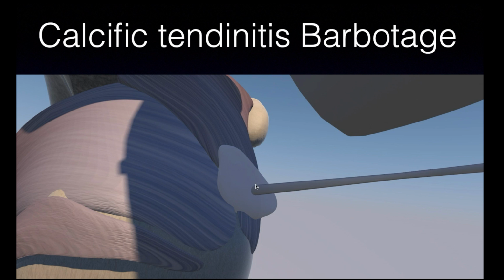So every time you inject saline, it's in a closed cavity, and the back pressure is going to come right back in your syringe. When you do these procedures, you don't have to actually pull back on the syringe. Once you inject, it usually just comes right back. And like Dr. Jacobson said, he had 3 syringes ready to go with saline. If you're not sure, maybe have 4 or 5, depending how big the lesion is.